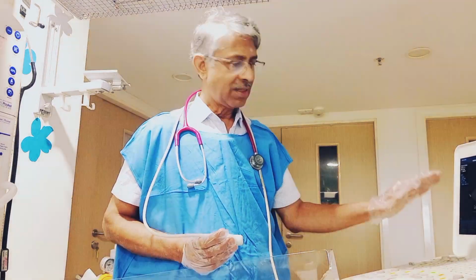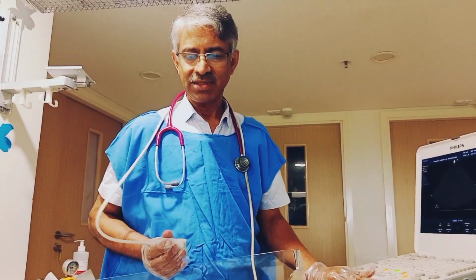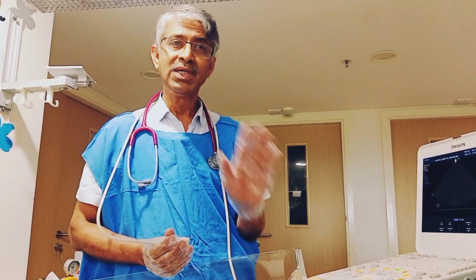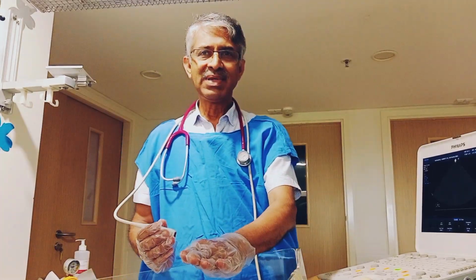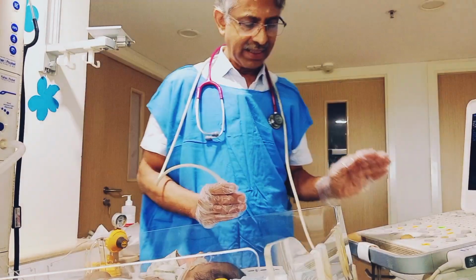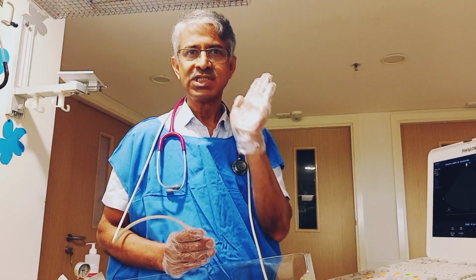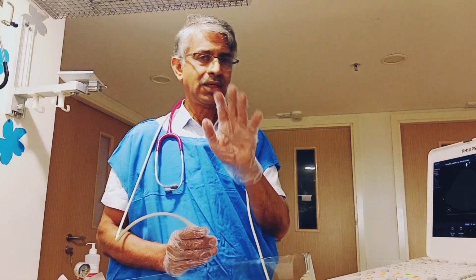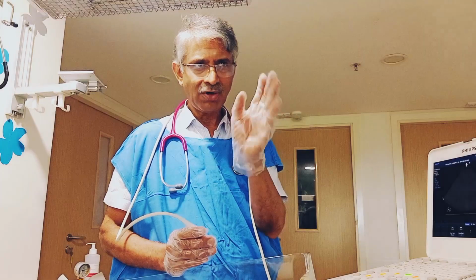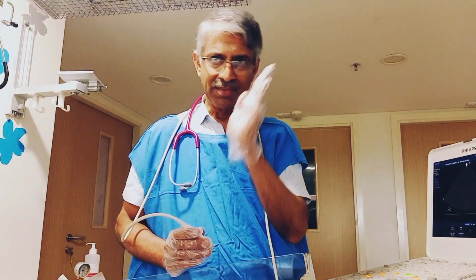Today, using echocardiography, we look at the normal heart and the heart with transposition of great vessels. How does the heart normally look? This is a normal baby, and I am going to show you the normal heart and three important areas you need to look at: the parasternal long axis, short axis, and four chamber view. You can understand the anatomy of the chambers connecting to the vessels, which is normal, abnormal.